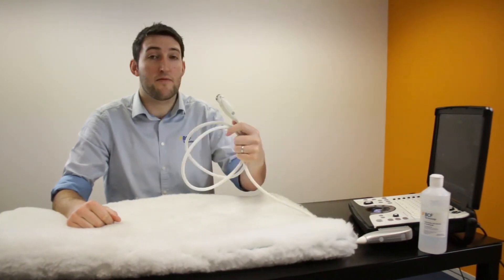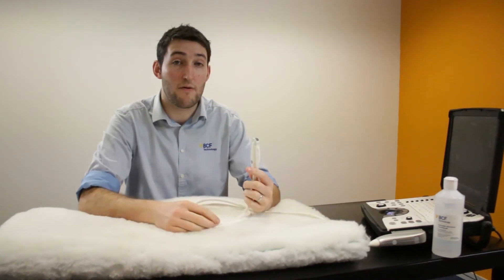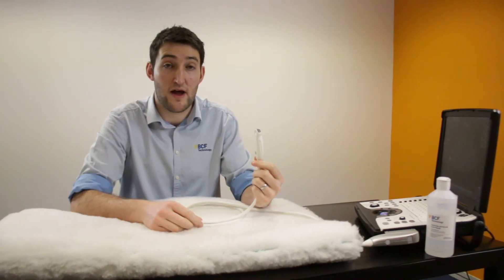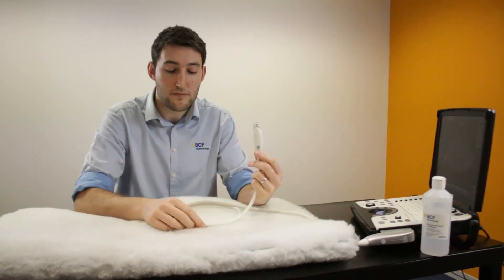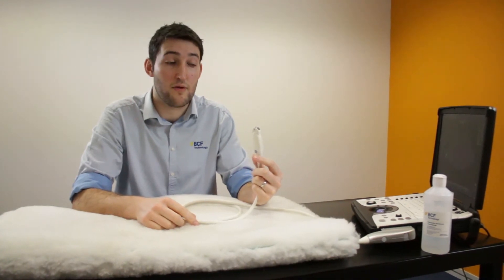We also need a probe to go with it, and if you have the option of picking from several probes, the one we want to go for is a microconvex probe. It's the sort of dual small animal abdominal imaging probe. It's got a nice small footprint so we get decent contact along the whole length of the probe, and it's great for looking into the abdomen of most small animals we see in practice.